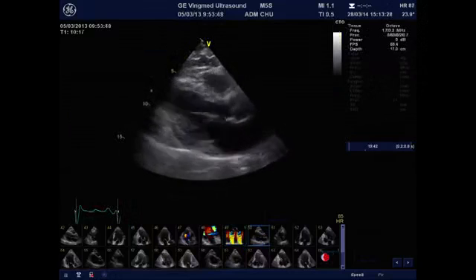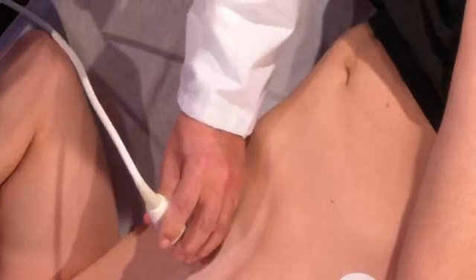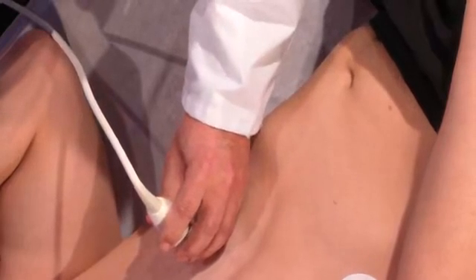So we decide to do an exercise echo, because if the patient is capable of exercising, and has no significant lung disease or vascular disease, it is better to use exercise rather than a pharmacological test because it will provide information on the evolution of blood pressure, and the significance of eventual ST segment depression is well known with exercise echo.